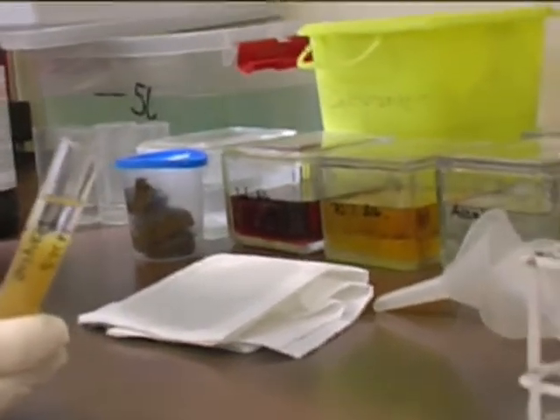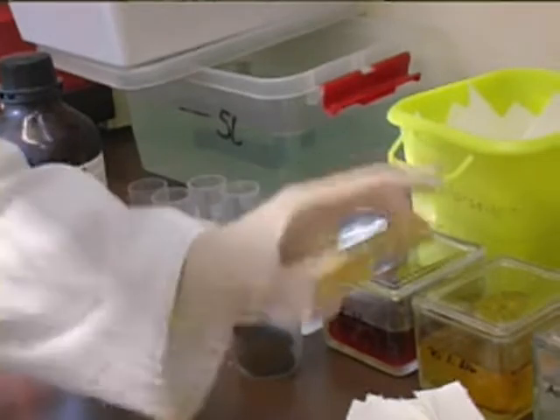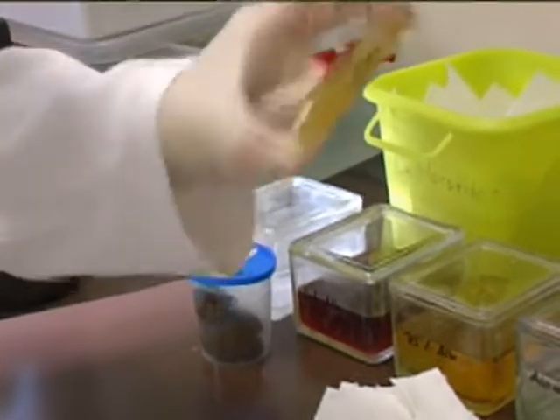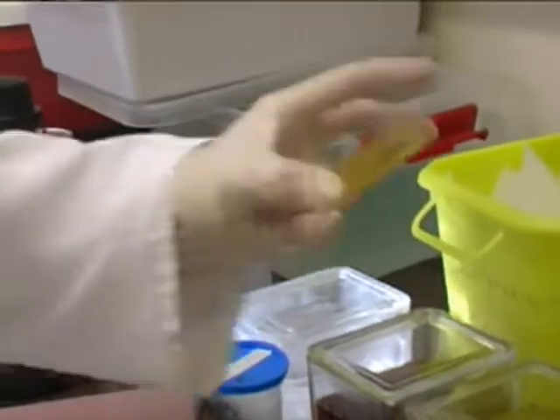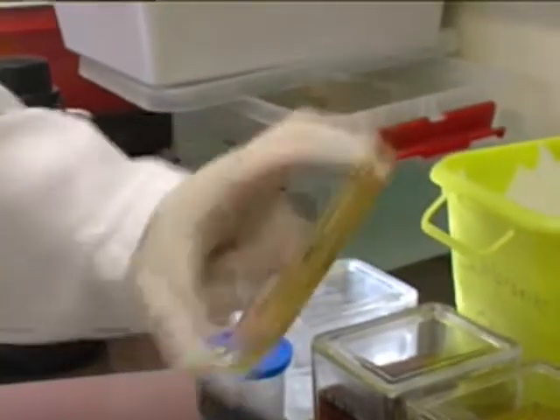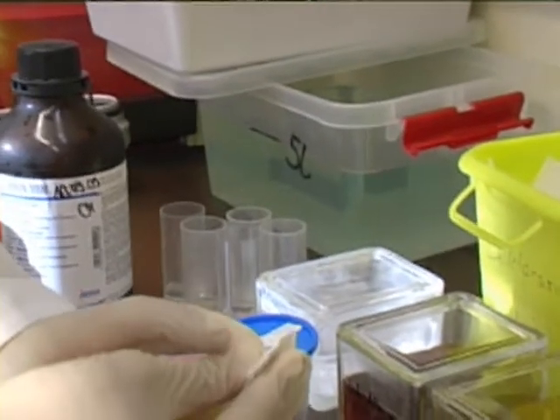So you have to disinfect the finger, your glove, with a disinfecting solution. You're shaking it, and you do this under the hood, under the laminar flow. Just thumb and middle finger. And there's a pressure, you can let it out. Sometimes you'll get some pressure. Okay, that's enough.